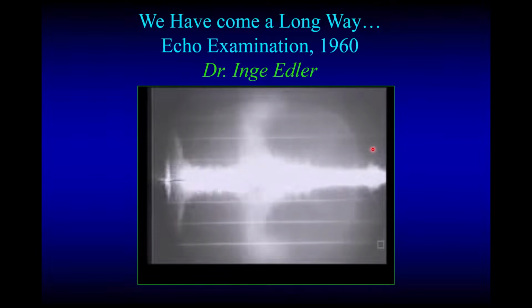Just imagine the change of these images to the current images, which are almost like real time in front of you. And I say that to many individuals, the beauty of echocardiography is that you could almost see anything that you're really interested in: structure, function, systolic function, diastolic function.